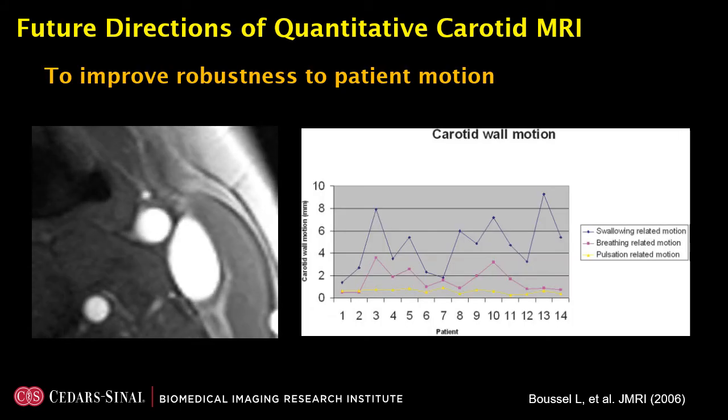So what's next? In my opinion, in our relentless pursuit of higher spatial resolution, patient motion during the scan will become a more prominent problem. A robust way to handle motion during the scan will be essential to improve quantitative imaging.